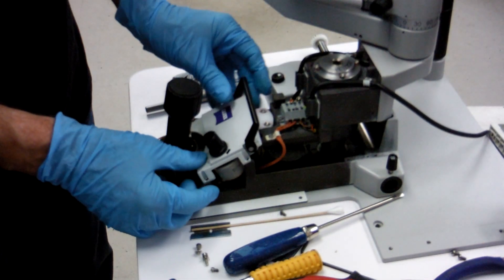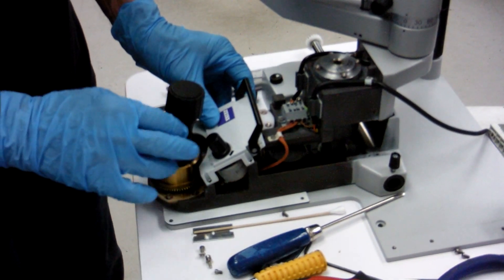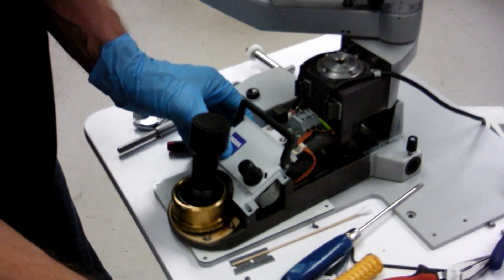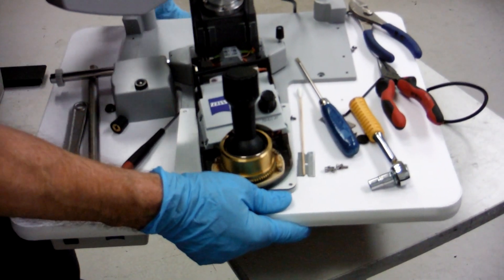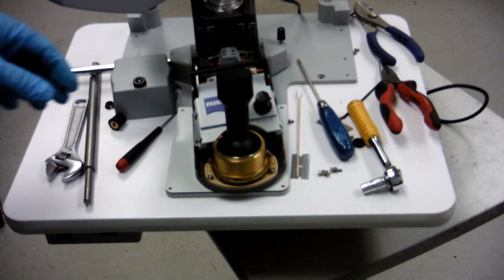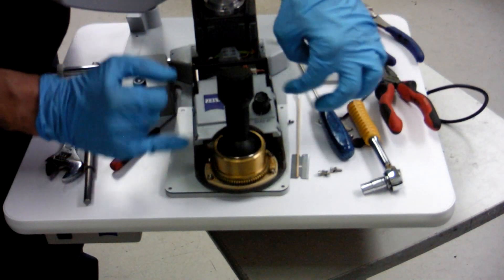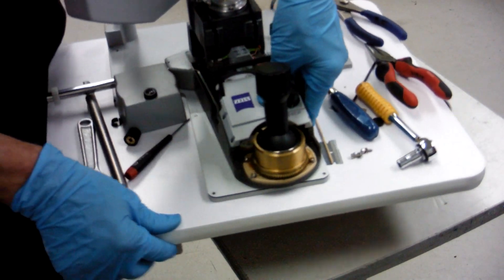Now you have access to your rheostat. Your rheostat housing has four screws. I've already taken them out. And your lock is over here.